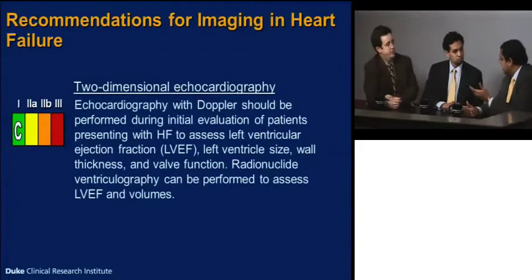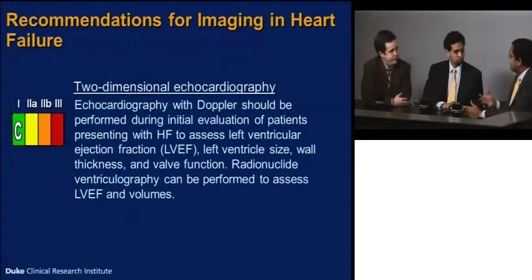As I suspect we're going to see the echocardiogram, but as I heard the case, Zubin, I was thinking acute coronary syndrome and then maybe complicated by heart failure. But as we hear about it more, maybe this person's been having heart failure for a while and now is getting tipped over into worsening heart failure that we are assuming might be ischemic, but we don't know yet. So let's take a look at the echo, if you have it, and see what you guys surmised on this patient.